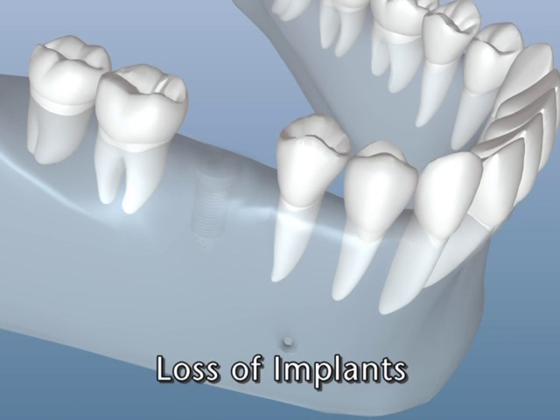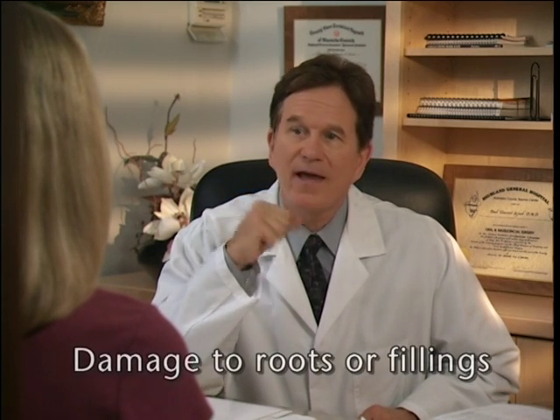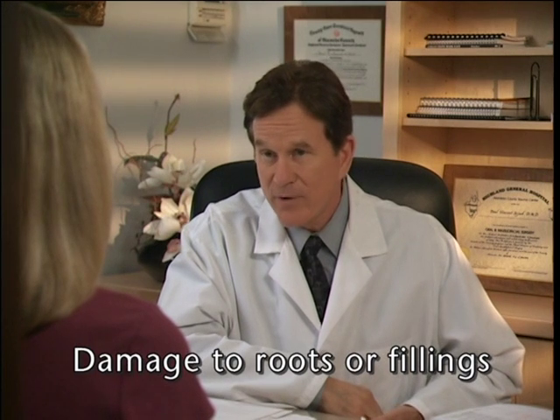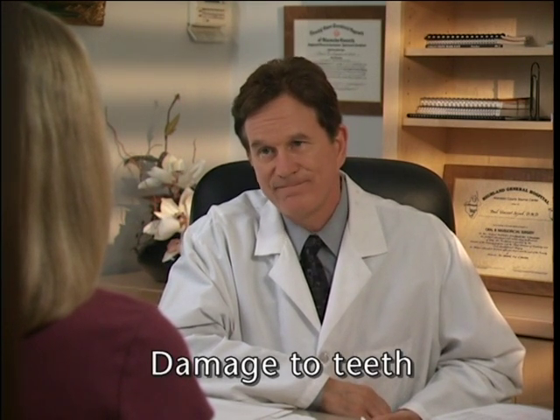However, if the implant is lost, we may be able to place a new one after the good bone healing has taken place. Besides swelling and bruising of the face and jaws, risks can include damage to tooth roots, which may later require root canal treatment or result in loss of teeth. Now, before I continue, do you have any questions? Nothing right now.